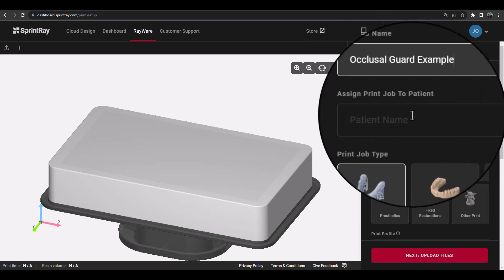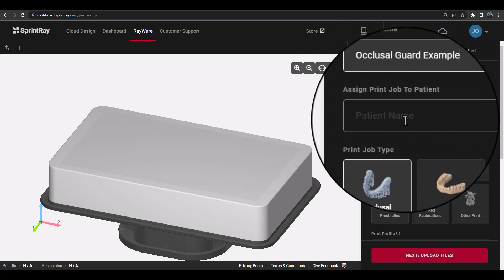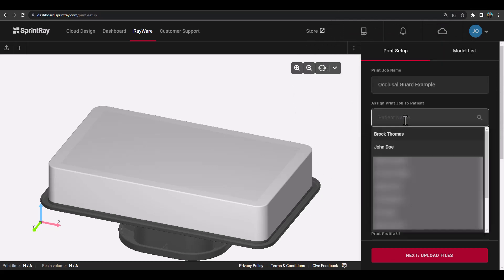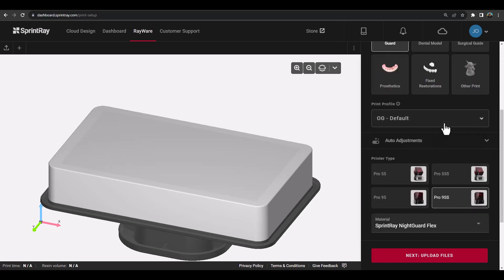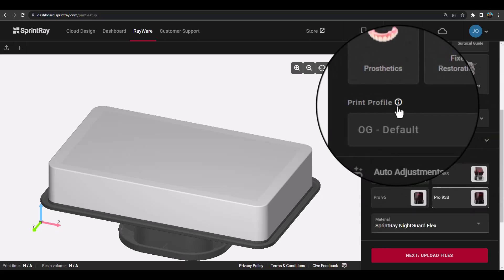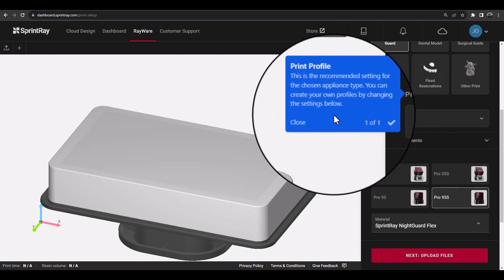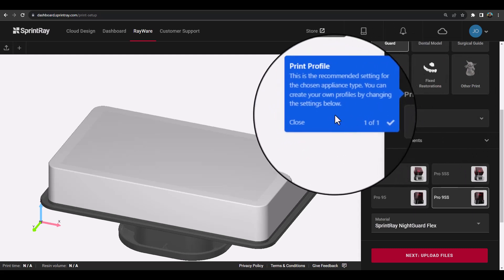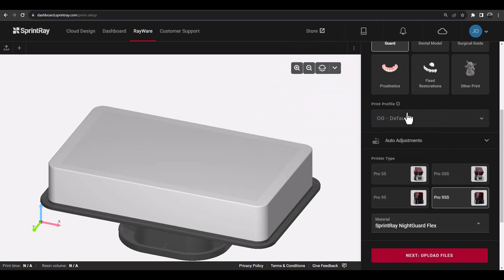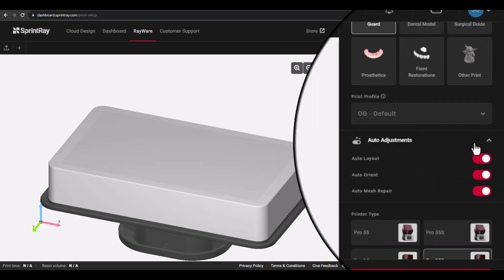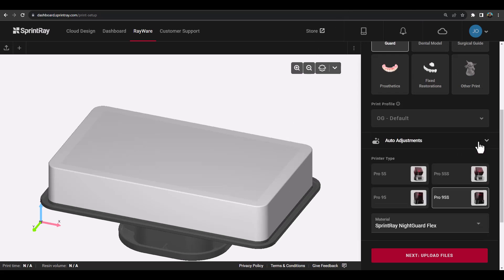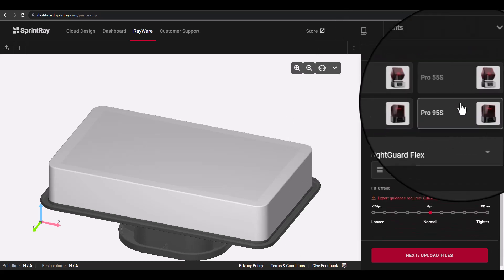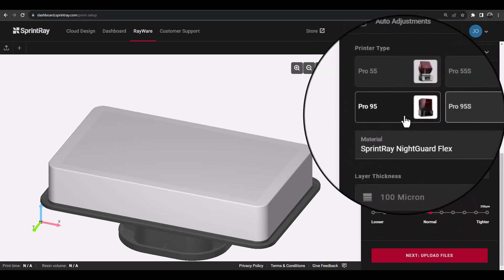If you wish, you can modify the print job name and assign it to a particular patient. And once an appliance type is selected, Rayware Cloud will default to the original print profile recommended by SprintRay. This uses the default parameters for the auto adjustments, such as nesting, orientation, mesh repair, and supports, and is the recommended print profile for most applications using this appliance type.